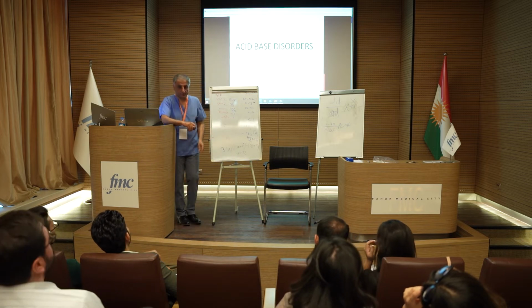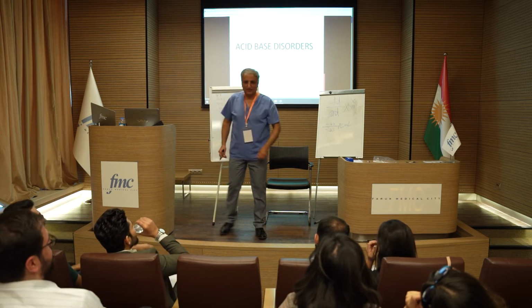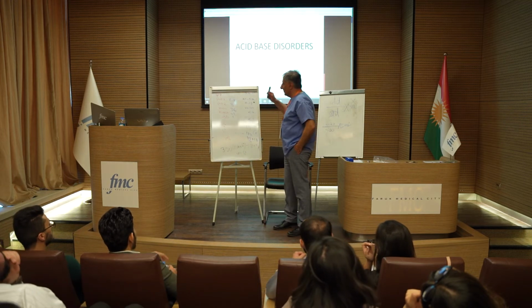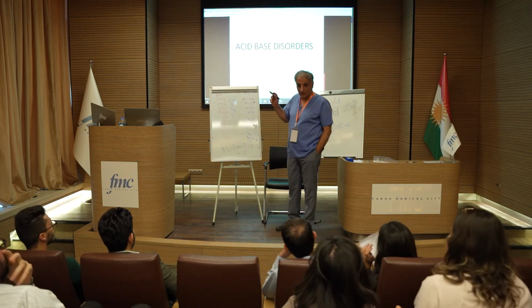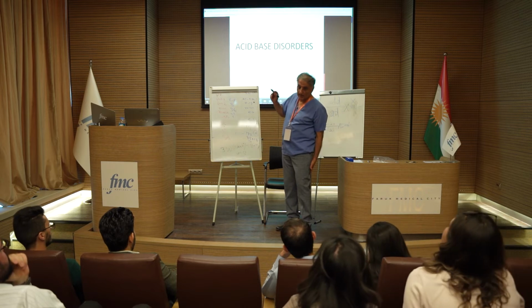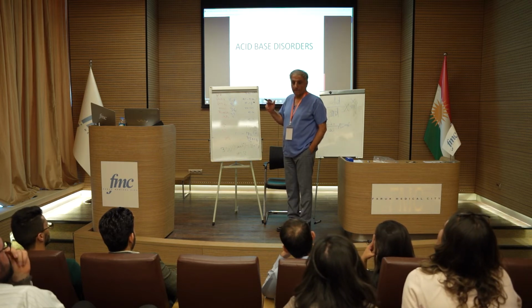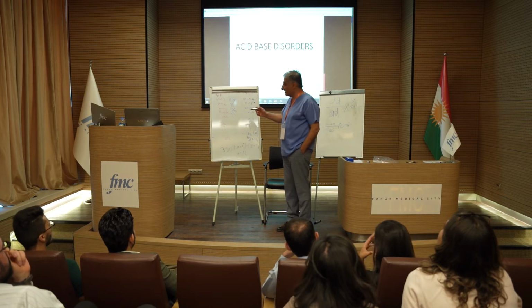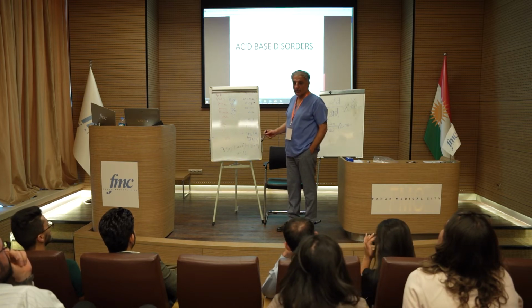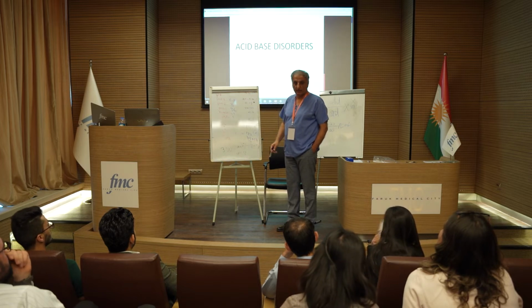You both attempt this. So pH is low, so acidemia, severe acidosis. Where is this acidosis coming from? CO2 is high. So that's the main acid there. It's 8.5, very high actually. And the patient is compensating, but is not achieving much.